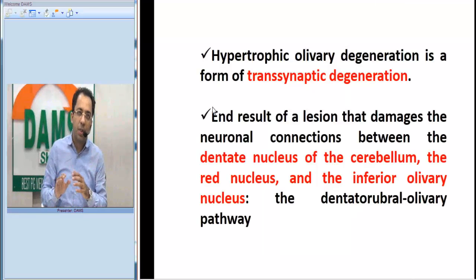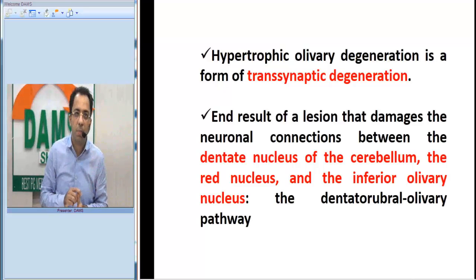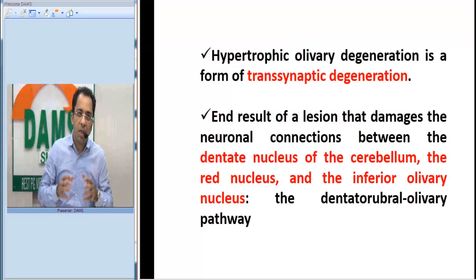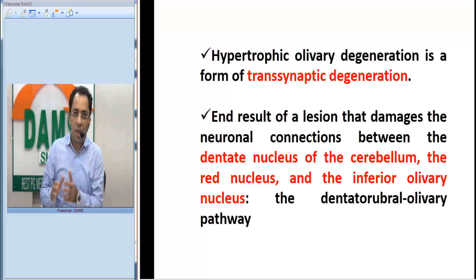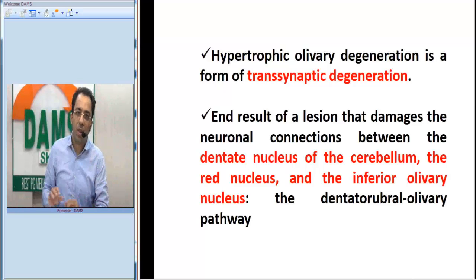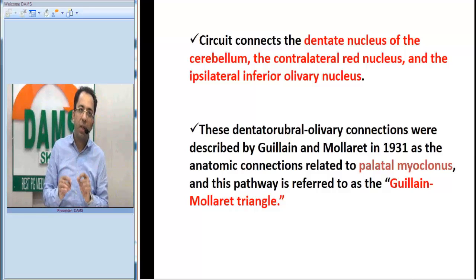This entire set of images represents hypertrophic olivary degeneration. It is a trans-synaptic degeneration resulting from a lesion — in this case, a hemorrhage — which damages the connections between the dentate nucleus, the red nucleus, and the inferior olivary nucleus. This entire pathway is also called the dentato-rubro-olivary pathway.